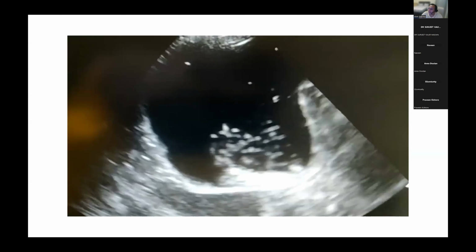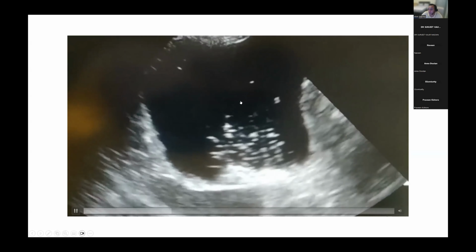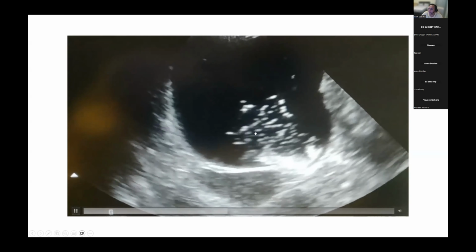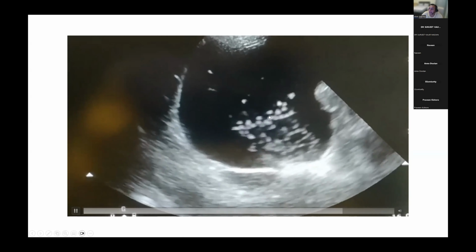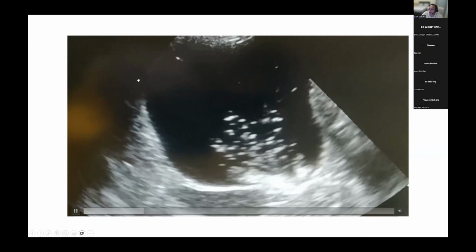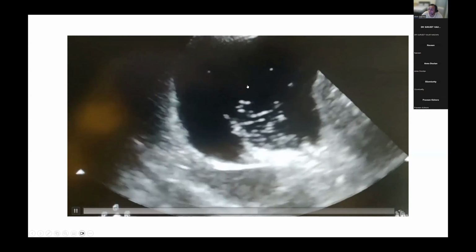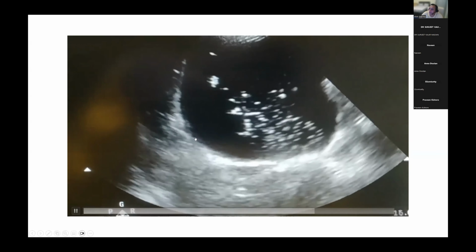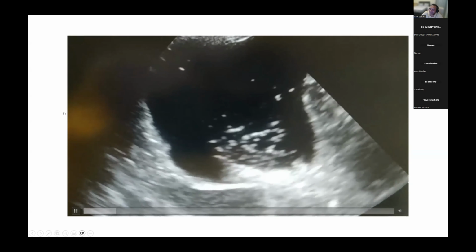I think we have punctured the lung. Very good. You've punctured the lung. So basically somebody has tried for most probably a diagnostic tap and has ended up puncturing the lungs. And what you have over here is basically a hydropneumothorax. Now, the pleura is not identified because a lot of this air is basically going in, but is not reaching the pleura. Because it's not reaching the pleura, you can't see a bright pleural margin.